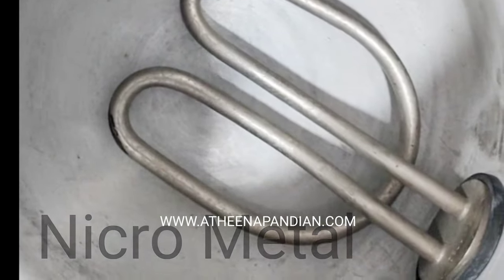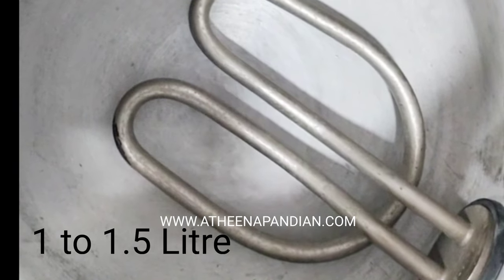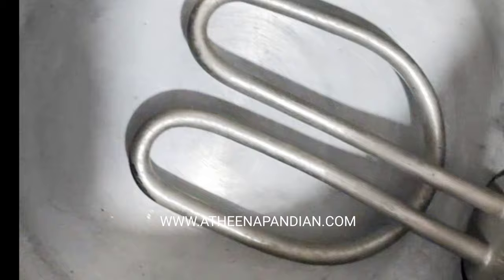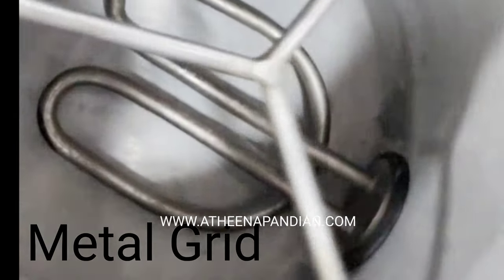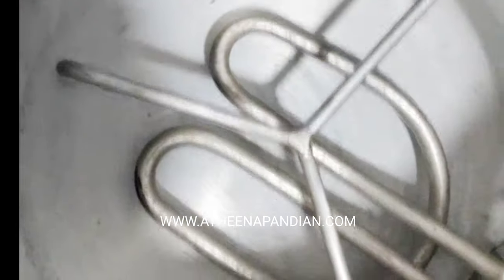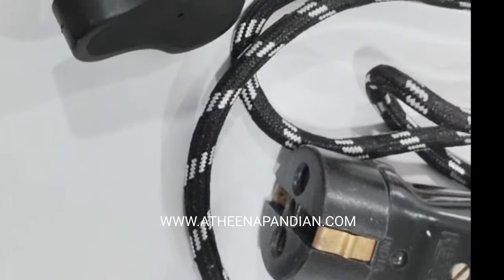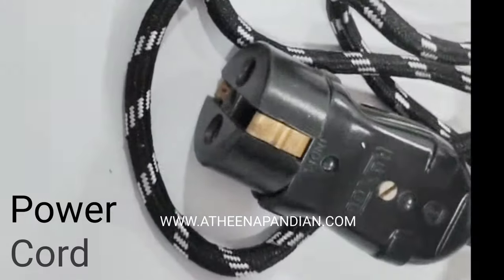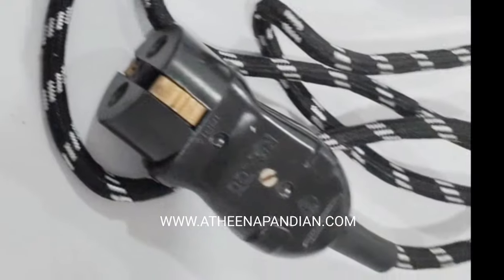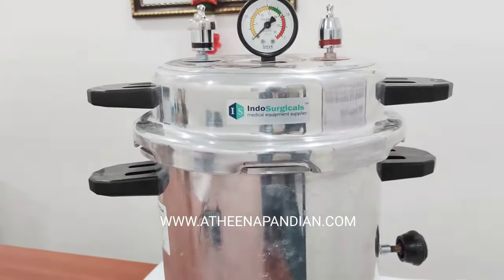The water capacity of the autoclave is about 1 to 1.5 liters. We have to pour 1 to 1.5 liters of water and place this metal grid inside it. Above this metal grid I am going to place my contents which are to be sterilized. This is the power cord of the autoclave. I am going to connect this port into the heating element port.